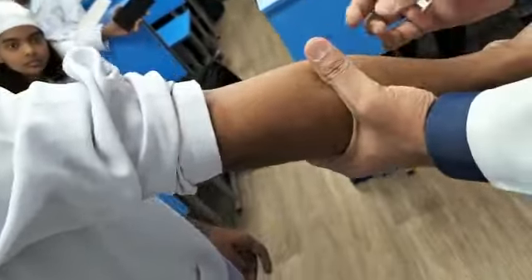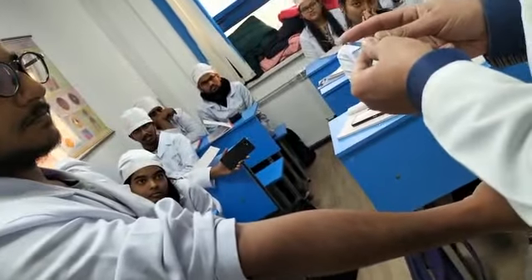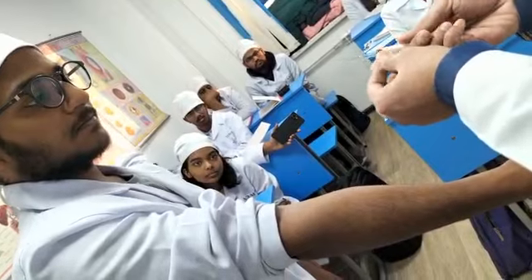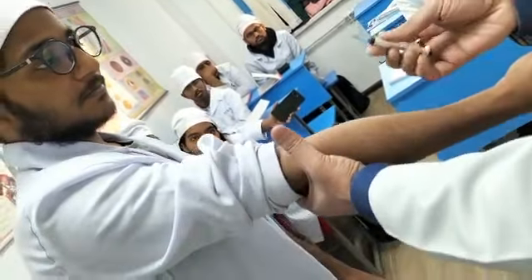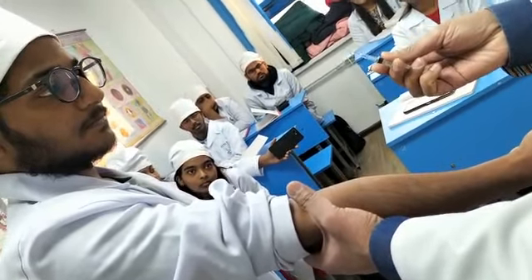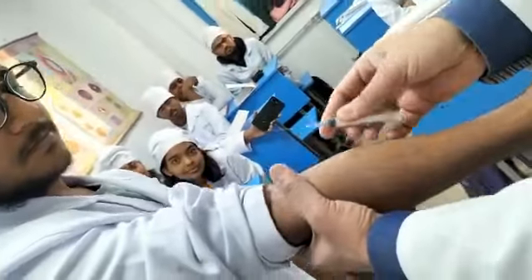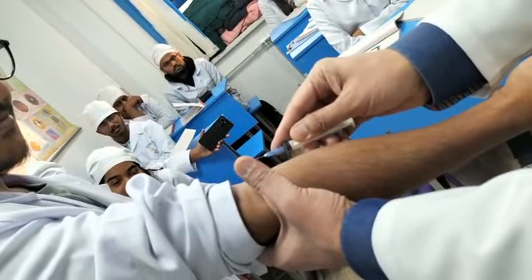You can see there — when we look here, for example, the veins are visible. Focus on the vein. Put the needle here. Place the cotton here. Before giving the injection, sanitize your hands. Do not touch your finger to the needle tip. Put the needle with the mouth always facing upside.